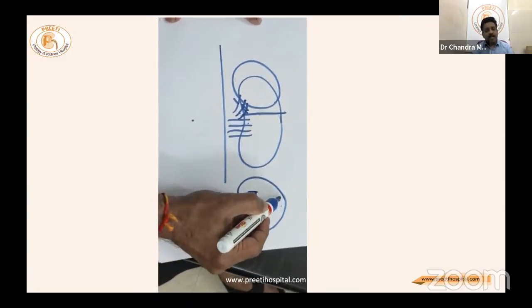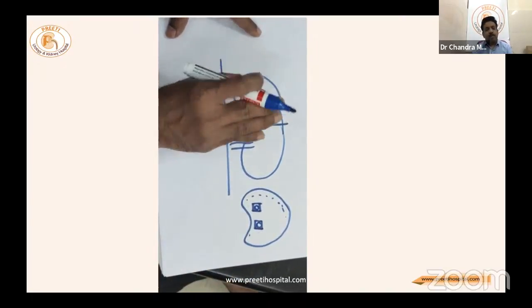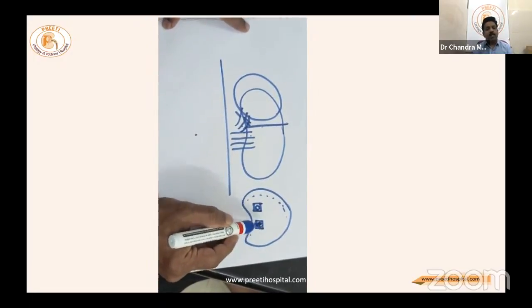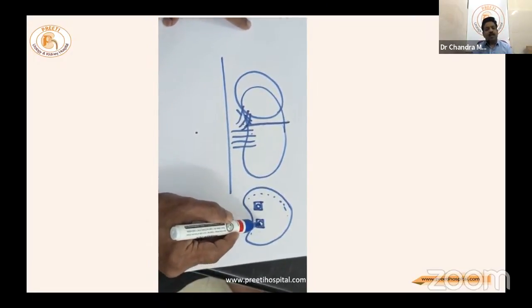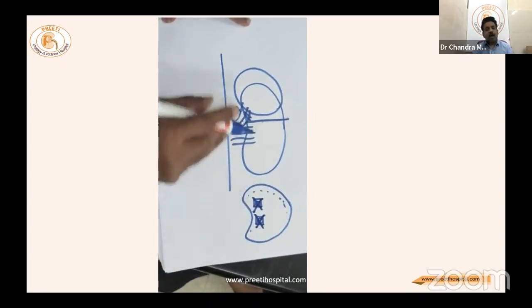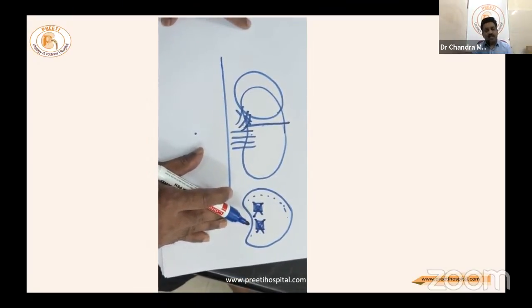The major vessels can be clipped. The rest of the kidney will not have any bleeders from the hilar part. The lower part vessels entering the parenchyma will be seen on the normal kidney remaining, and they can be clipped or sutured with Vicryl using a cross X-stitch.